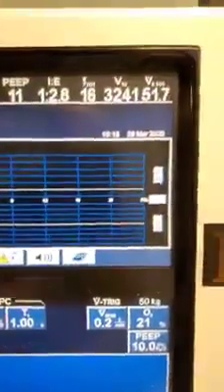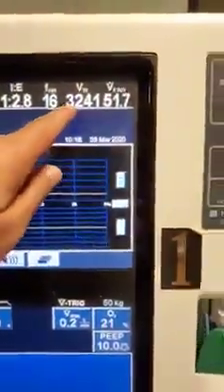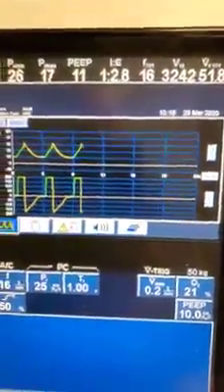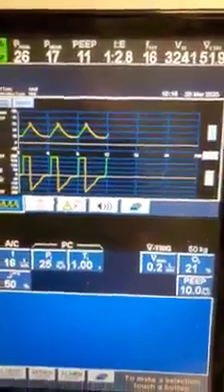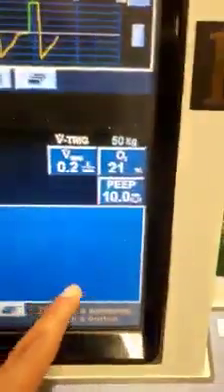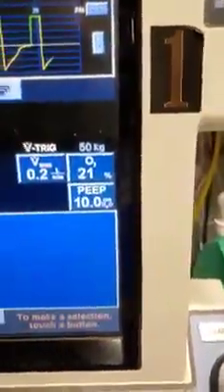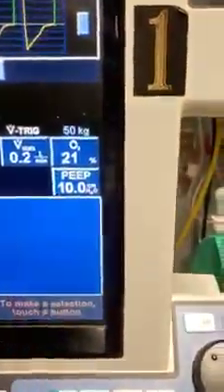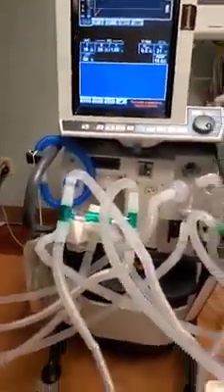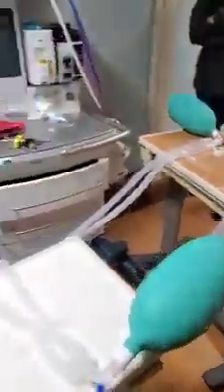With the inspiratory pressure of 25, we are actually getting a tidal volume of 3,241. Now that number scares you, but you have to divide that by seven, and it comes down to around 450-470, which is exactly what you would want on these patients. We are using 21% oxygen because we don't want to waste the hospital's oxygen. We put a PEEP of 10, and we can go up on the PEEP more. Each one of these patients is getting a volume based on the exact settings we have set up using the pressure control ventilator. With this strategy, we can actually do ventilation for seven at this time, but far more.